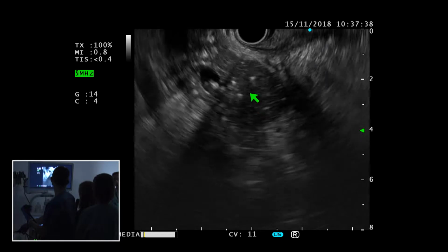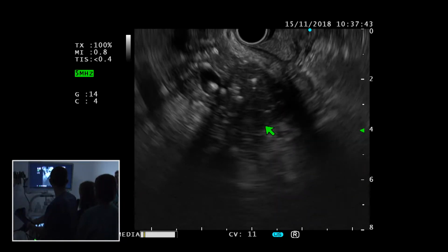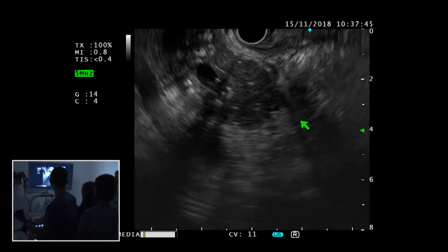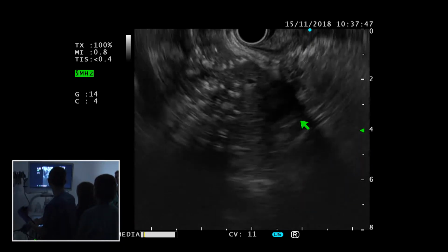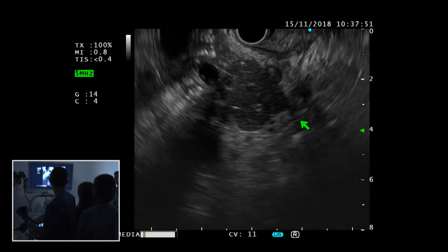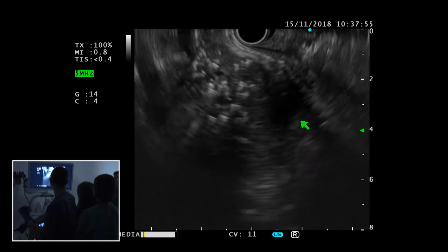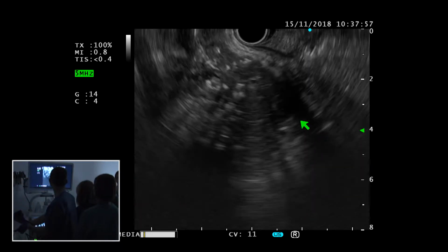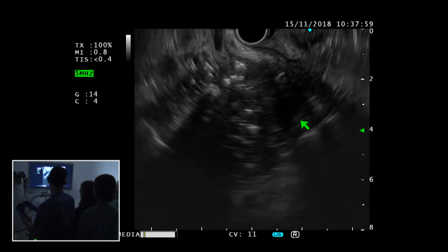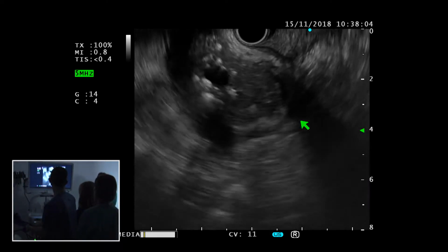What do you find different in this area? There aren't many calcifications like in the rest of the gland, and it's less echoic, quite roundish. It's obviously difficult to assess focal lesions in a pattern of chronic pancreatitis.